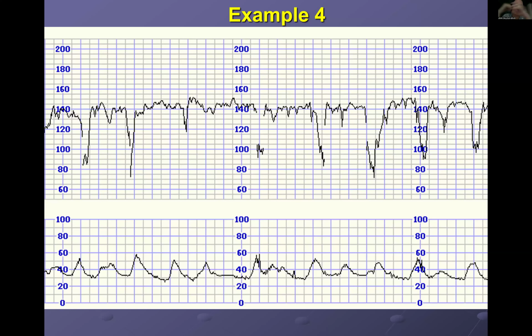have her monitored continuously. Given the previous section, I would still prepare, take the bloods, put in a cannula. Of course, I will not start oxytocin because she already has contractions.